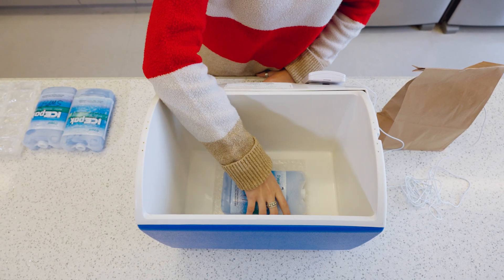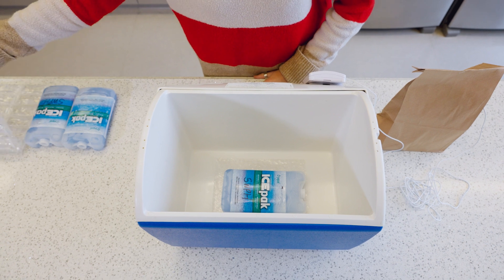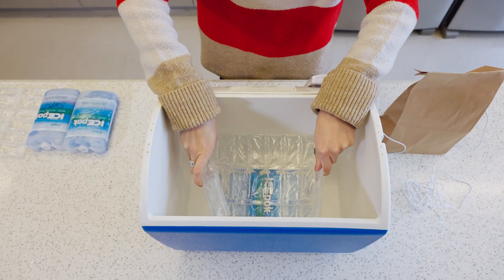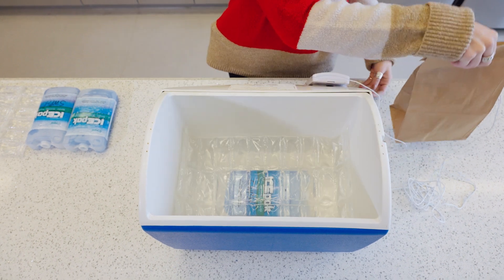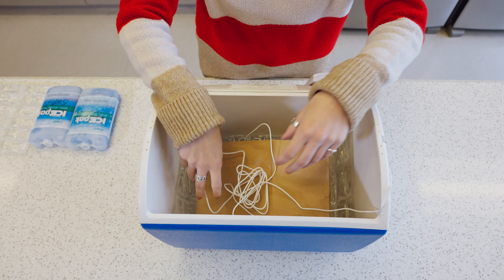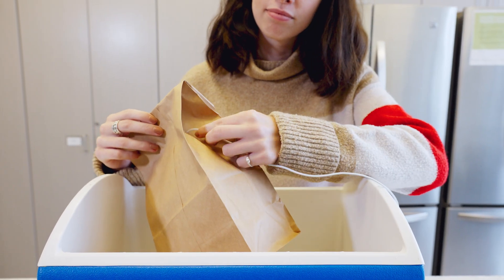Place one or two ice packs at the bottom of the insulated container. Place a preconditioned ice blanket — two to eight degrees Celsius — on top. Then place the vaccine package on top of the ice blanket. Position the temperature monitoring device or sensor in the center of the vaccine package.